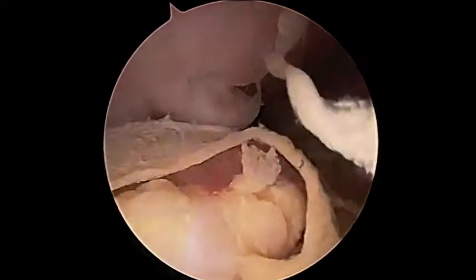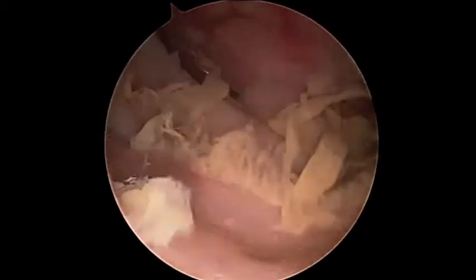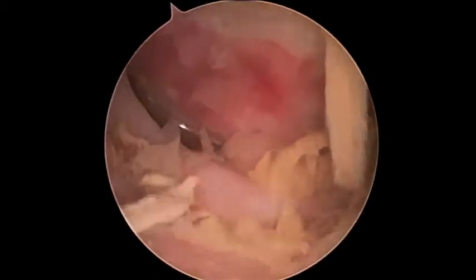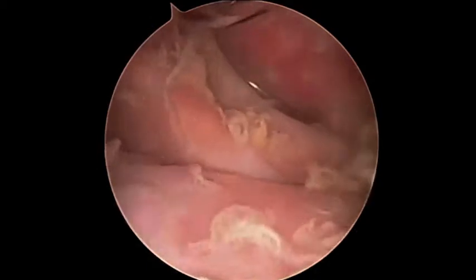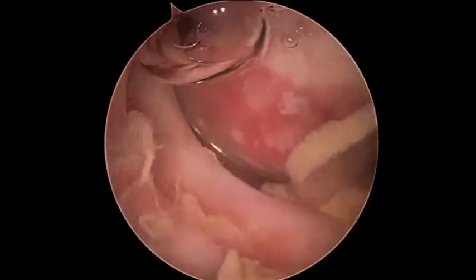Hip arthroscopy provides a simple and accurate method to obtain good quality biopsy specimens of the soft tissues adjacent to the arthroplasty.